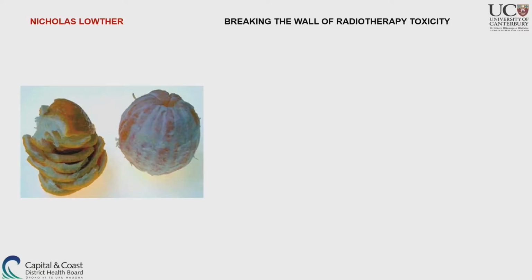My research is looking at whether we can safely reduce the margin in radiotherapy. As demonstrated by this peeled orange, even reducing the margin by a small amount leads to a large reduction in the total volume of tissue that receives radiation. My research is developing a software tool that enables us to detect if we're at risk of underdosing a cancer or overdosing healthy tissues.